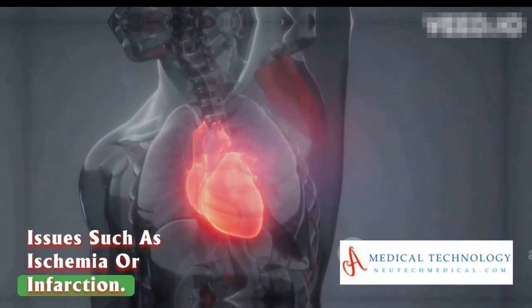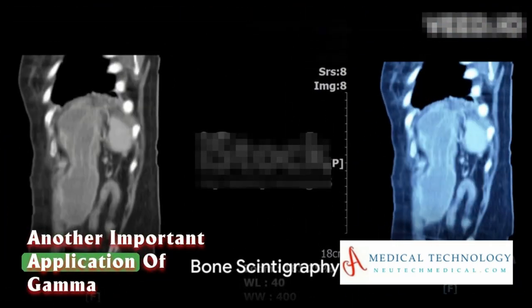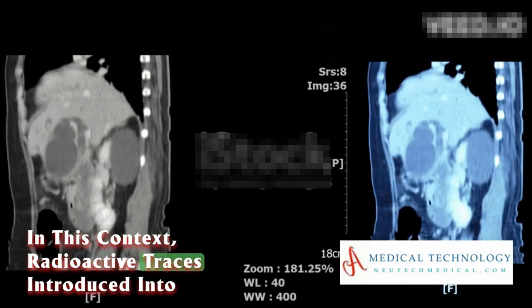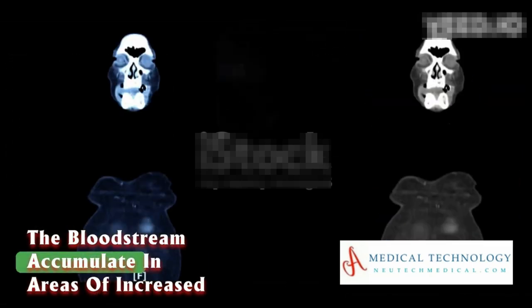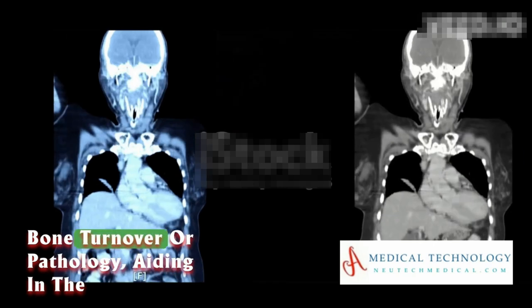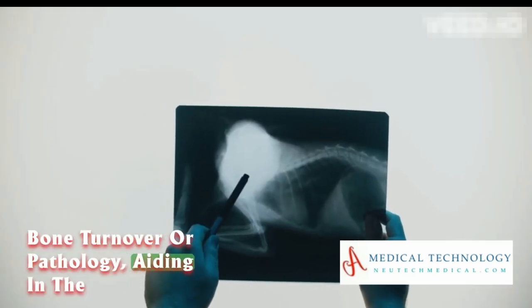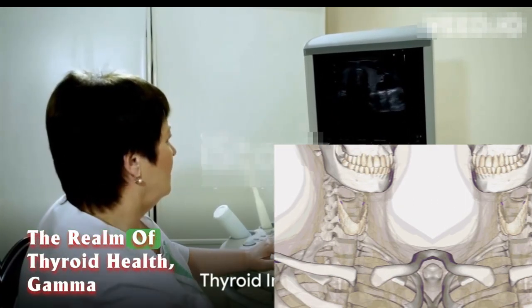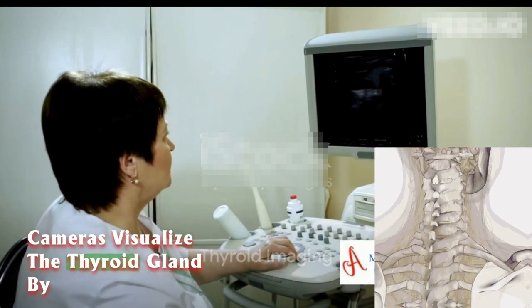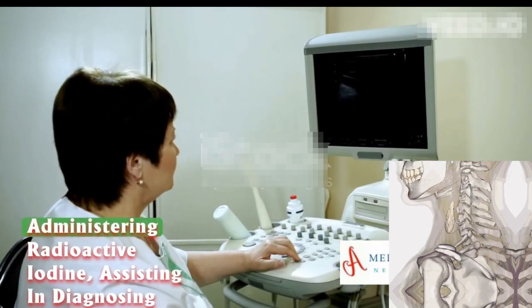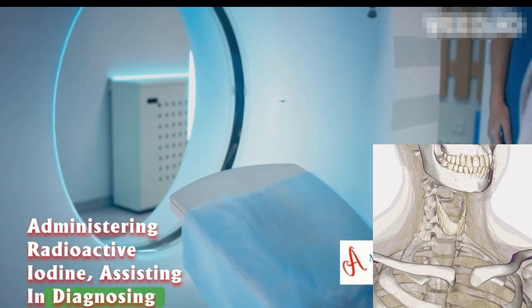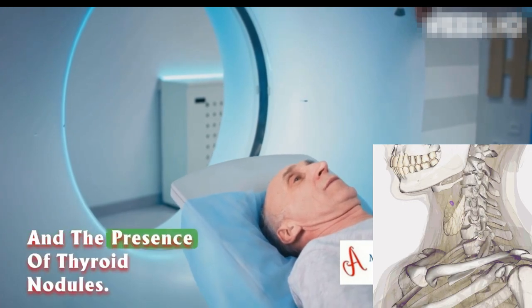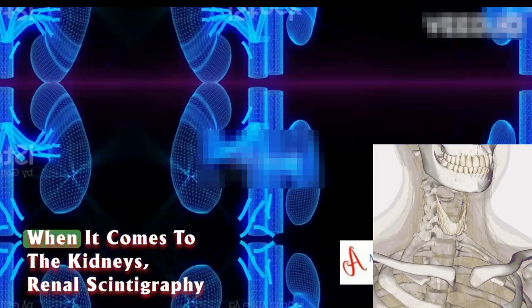Another important application is bone scintigraphy. Radioactive tracers introduced into the bloodstream accumulate in areas of increased bone turnover or pathology, aiding in the identification of fractures, infections, or tumors. In the realm of thyroid health, gamma cameras visualize the thyroid gland by administering radioactive iodine, assisting in diagnosing disorders such as hyperthyroidism, hypothyroidism, and thyroid nodules.